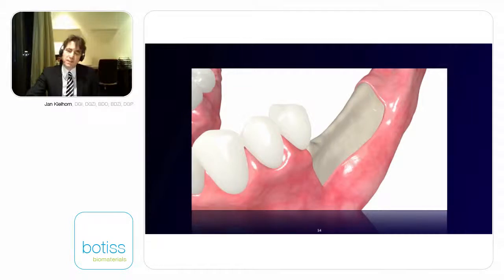We seem to get the best effect if you also use allograft material, because allograft mixed with autogenous bone gives you that sort of sticky bone, especially if you mix it with PRF, that is nicely moldable, gets a nice blood clot, and is very stable, while a synthetic or other material like bovine structures is not as moldable and will not give you the same outcome.